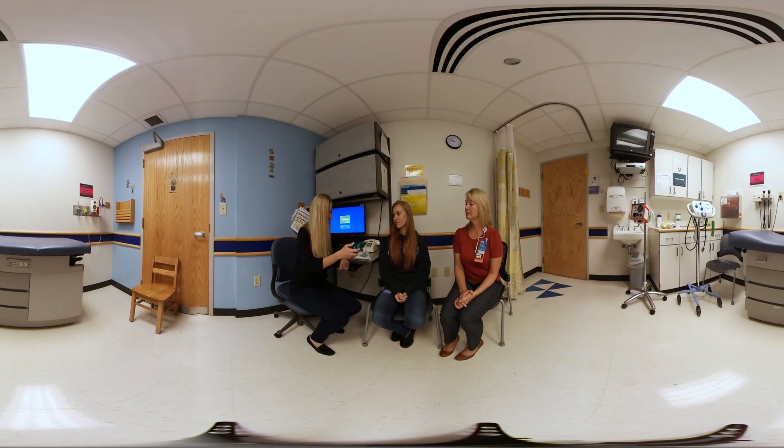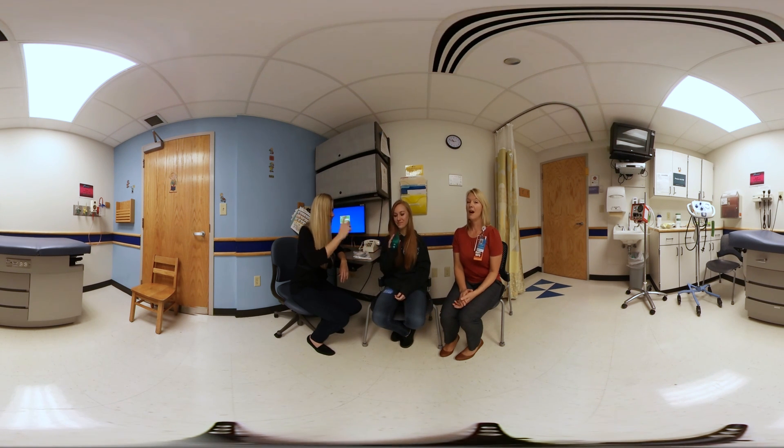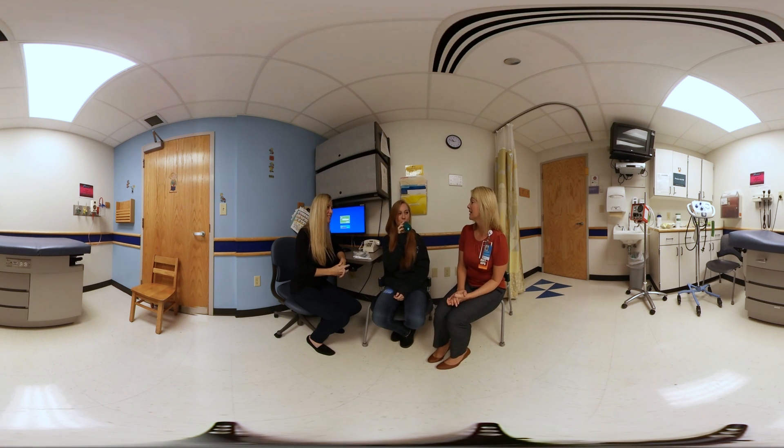I'll go ahead and let Shailen demonstrate now. It's really important to coach your patient to take a big, deep breath in, hold it for about three seconds, and then blow out forcefully — pretty forcefully, but not all out.